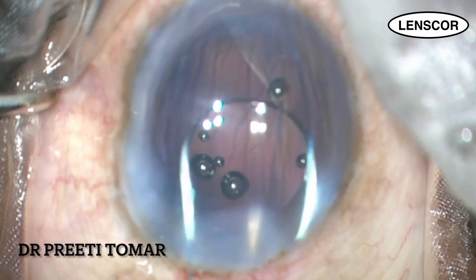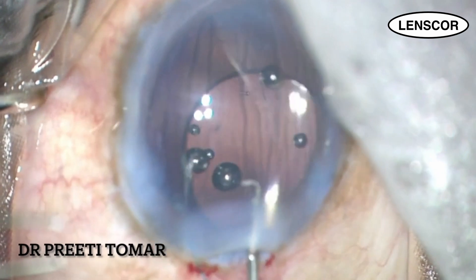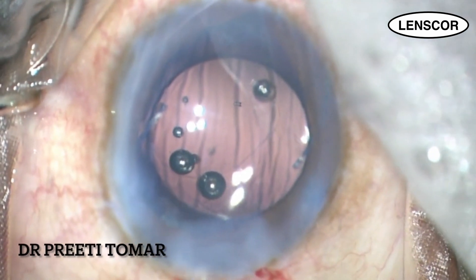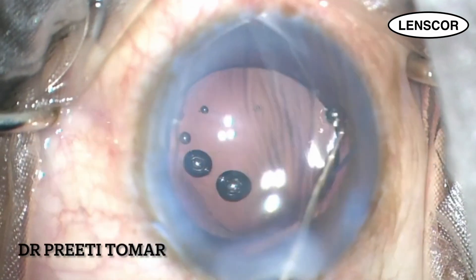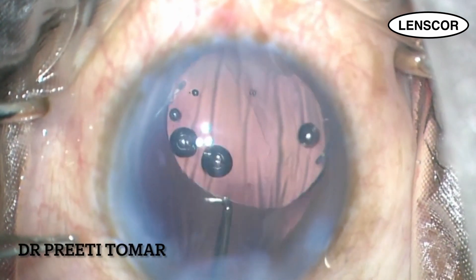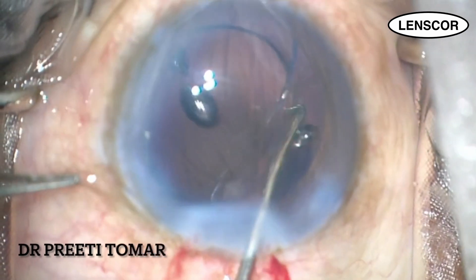While IOL implantation, the leading haptic should be aimed towards the sulcus and not downwards. Once the leading haptic is in place, it's easier to rotate the trailing haptic. After sulcus fixation of the lens, the edges of the lens are tucked in below the rhexis margin — this is known as optic capture — making the intraocular lens more stable.